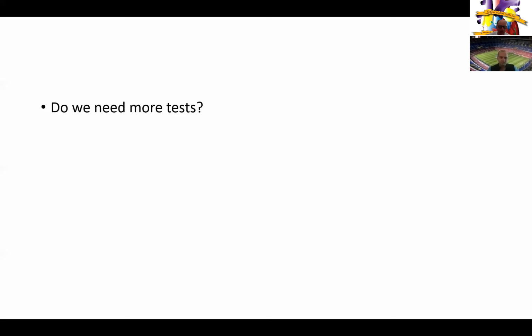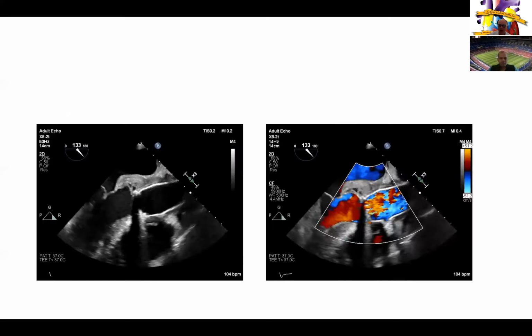That's another factor. Again, it's almost like an accelerating stepwise thinking, where you start with an EKG actually, then a surface echo, then a TEE. Often with patients with mechanical valves or bioprosthetic valves or any valve replacement or even pacemakers, I think a transesophageal echo is essential. You should never stop at a surface echo, and that's supported by the guidelines. Yeah, I agree. So that's what we did.